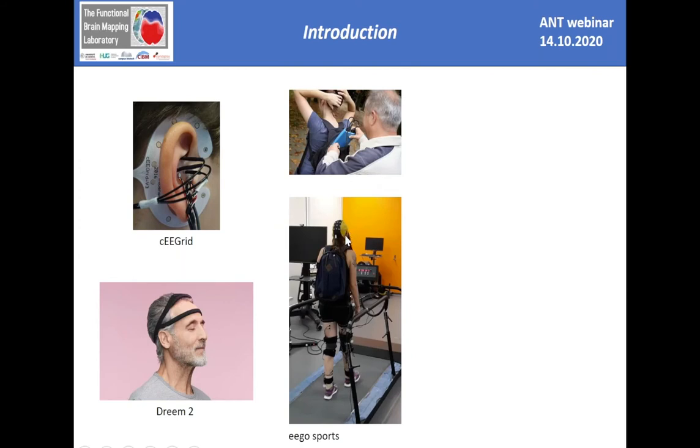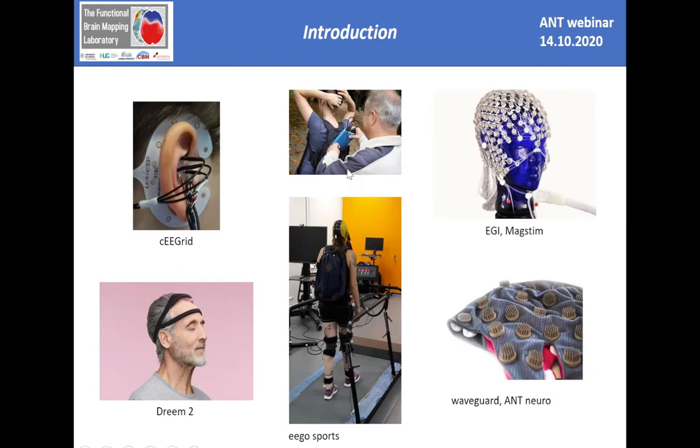setup that is usually used for clinical research or field research. You can see here a wearable EEG cap, and the amplifier is usually in a backpack or remote, and these systems are usually used in a clinical setting or a field setting. But if you're more interested in basic research, you usually go even more high density, where you use these high density EEG systems.